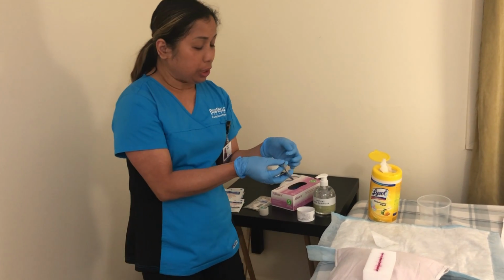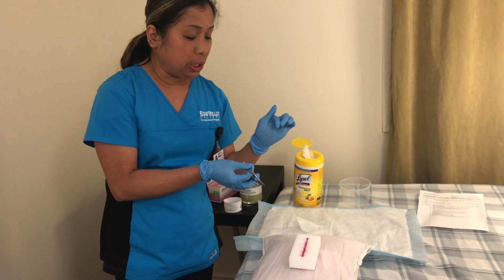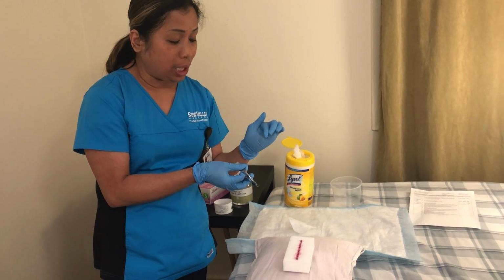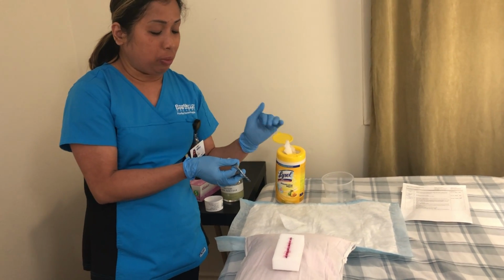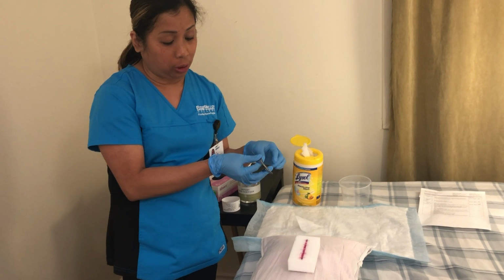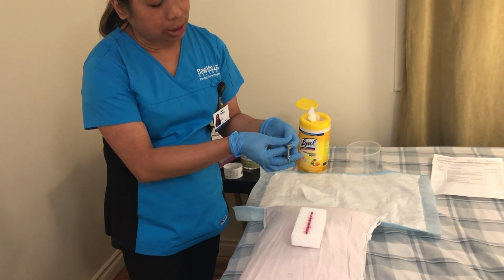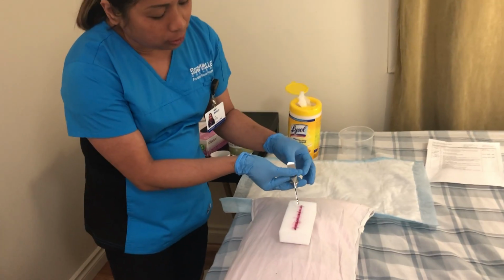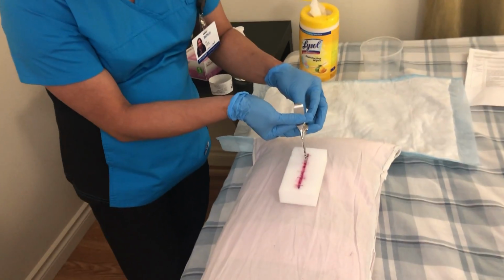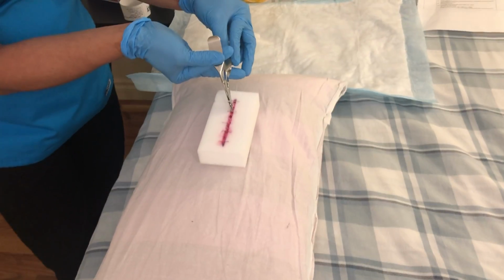Okay, now I'm going to remove two staples, the second one and then the fourth one. The remaining ones will be removed tomorrow, and you have to inform the patient of that. So now, the two teeth go under the staple like this, at the center.